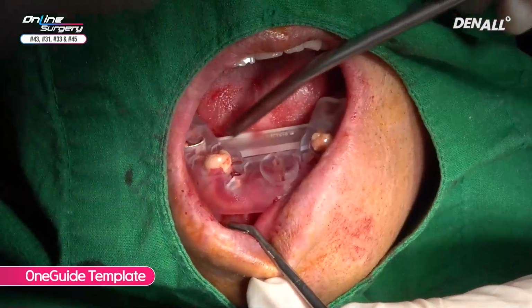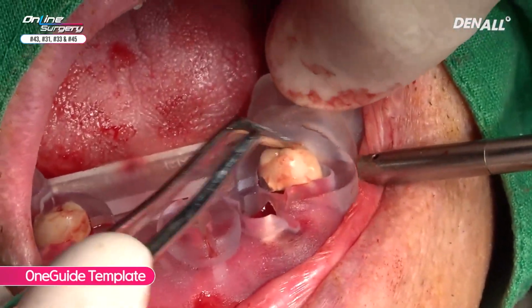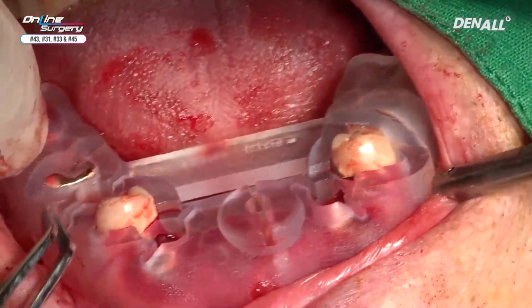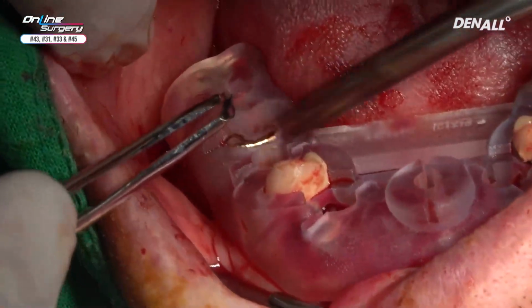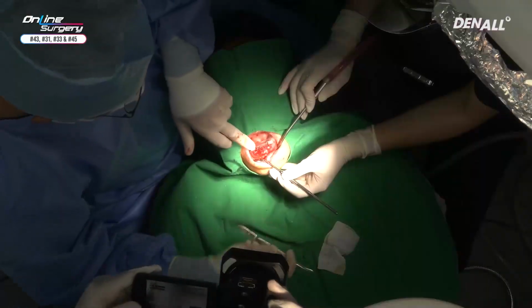What you need to focus is here. It needs to fit perfectly. Over here and here. By having a nice fit, we can be rest assured that the guide went in.